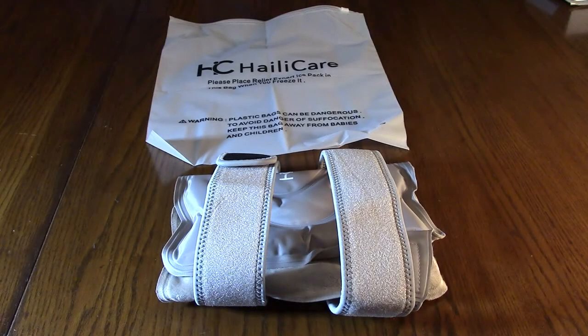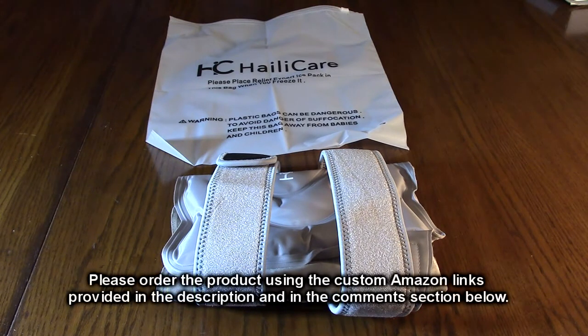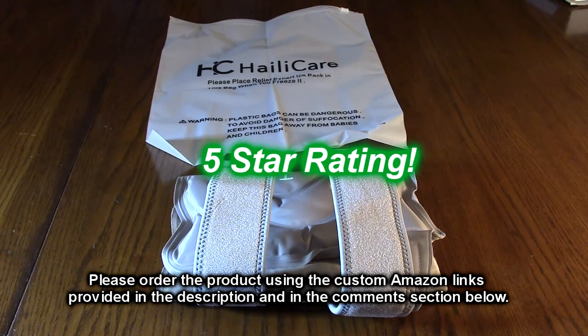So what's my overall impression of the HailiCare knee ice pack for injuries with the reusable gel? As I demonstrated, this can be used warm or cold depending on your application and what kind of injury you're healing from. It seems to work really well and has very sturdy construction. I'm going to give this product a full five-star rating.